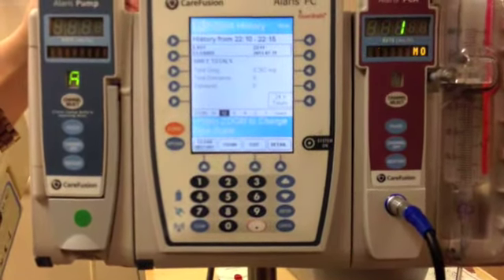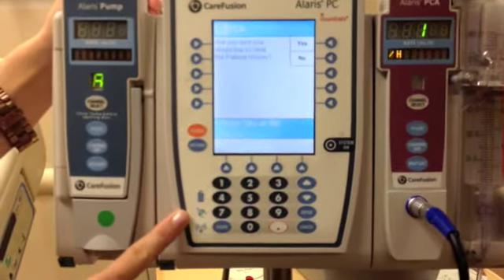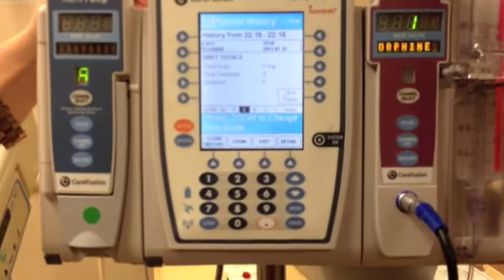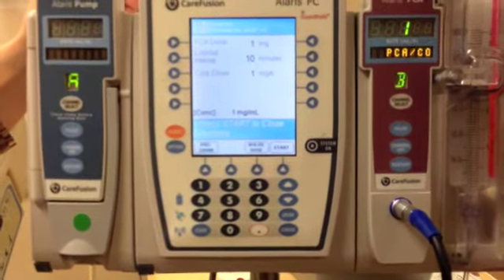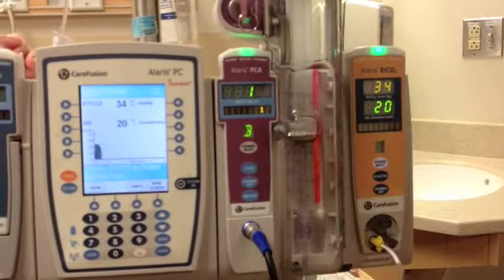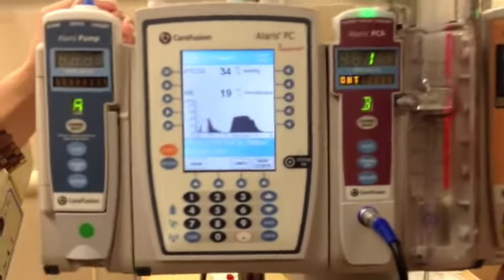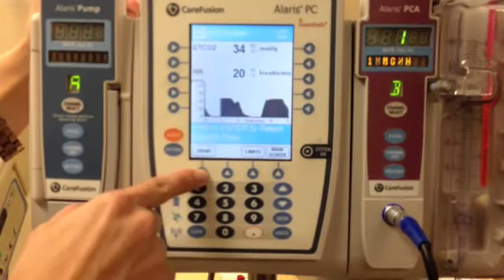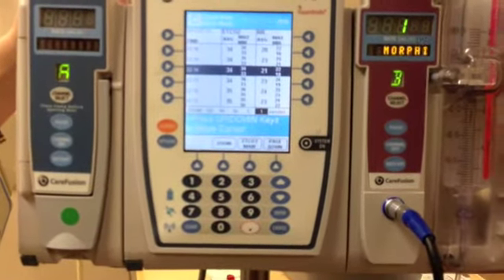At the end, you will now press Clear History on the bottom of the screen. Press Yes to clear the history. Now exit. Review the end-tidal CO2 by channel selecting on the end-tidal CO2 compartment. Verify the end-tidal CO2 on the screen. To look at the trend, press the Trend button on the bottom screen. Review with the nurse to make sure that the values are verified.